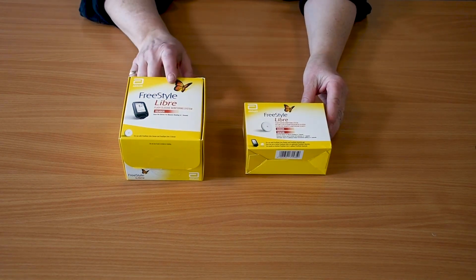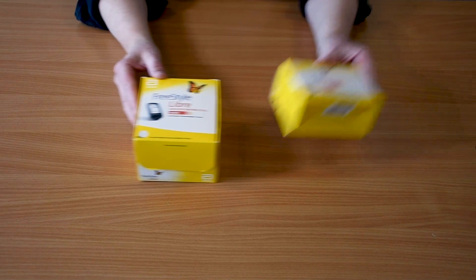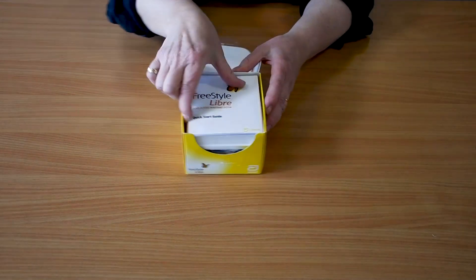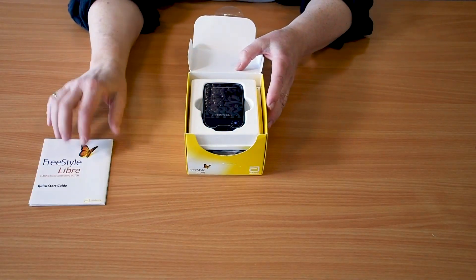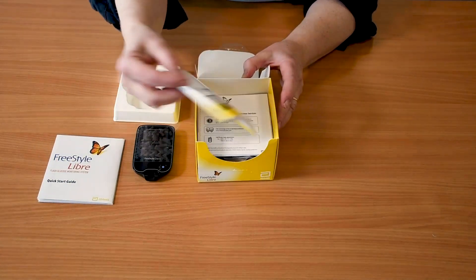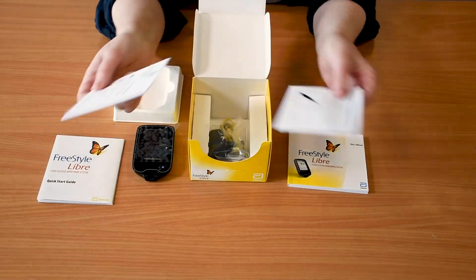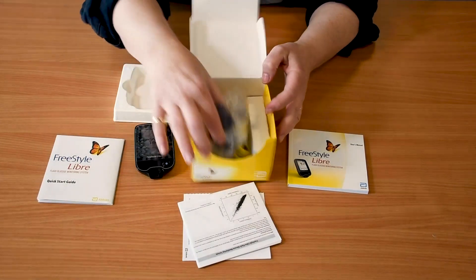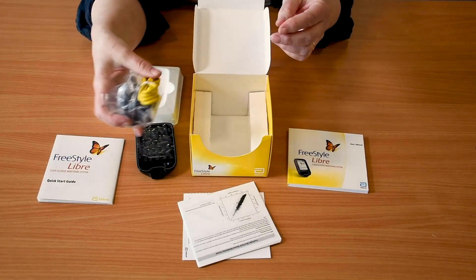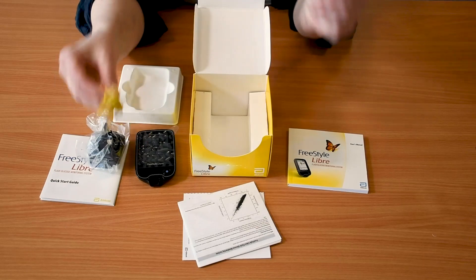Here is your Libre starter kit. It consists of the box containing the reader and the box containing the sensor and applicator. Inside the reader box you will find a quick starter guide, the reader itself, a Freestyle Libre user manual, various other pieces of useful information, and a plug and cable to charge the reader and download data to your computer.